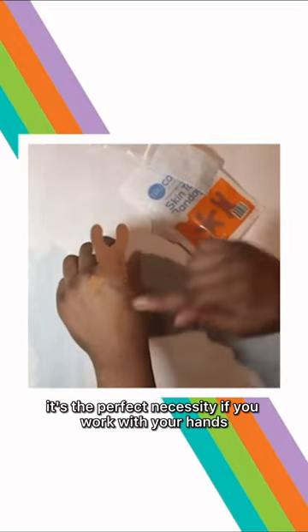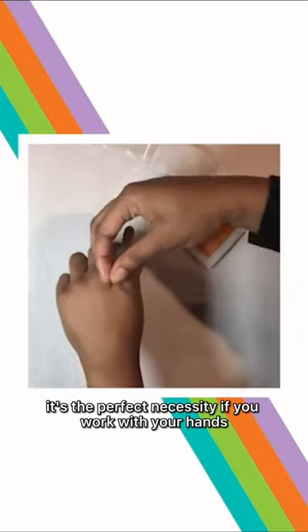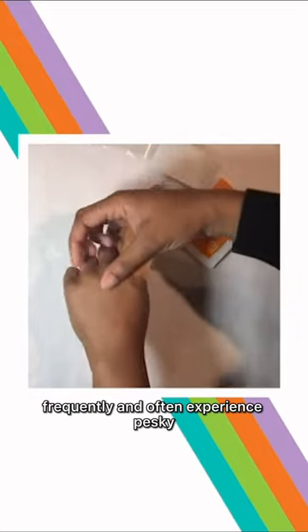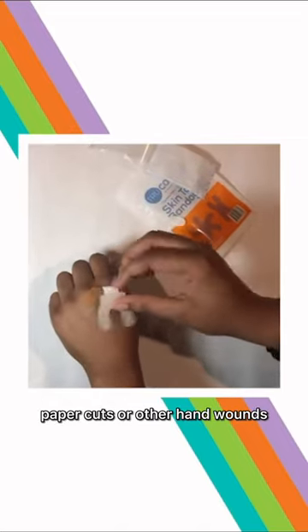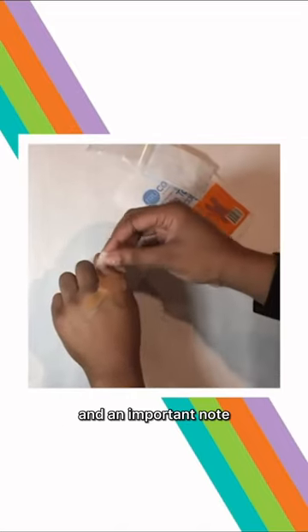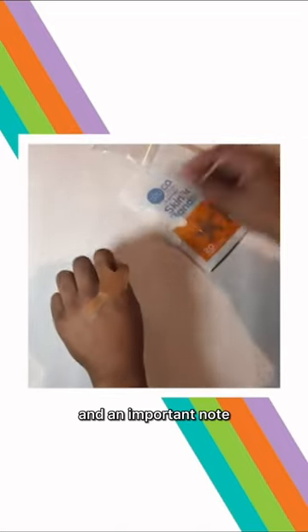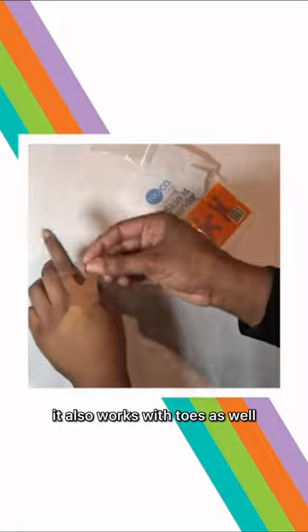It's the perfect necessity if you work with your hands frequently and often experience pesky paper cuts or other hand wounds. And an important note, it also works with toes as well.